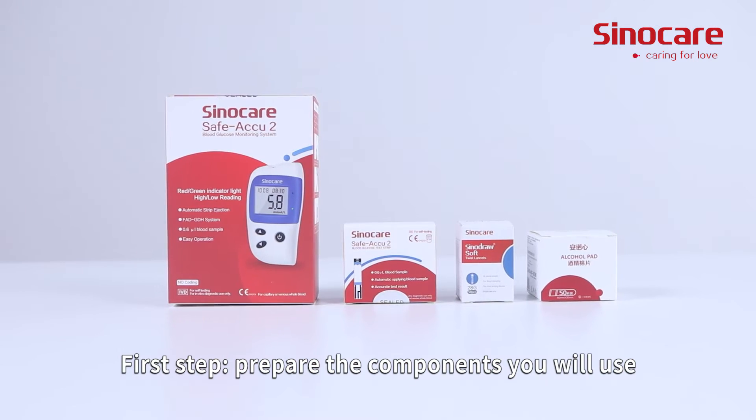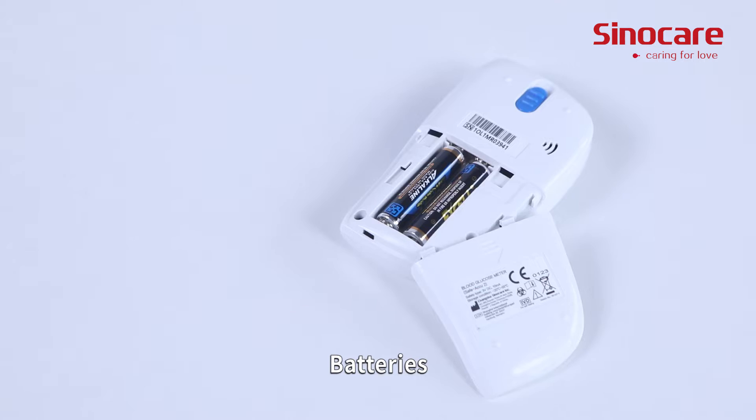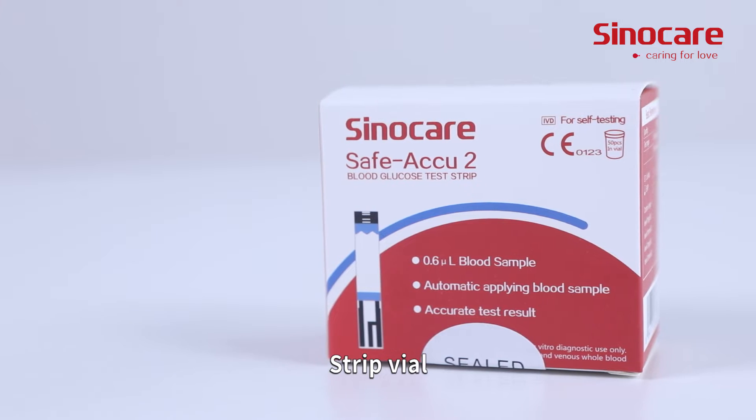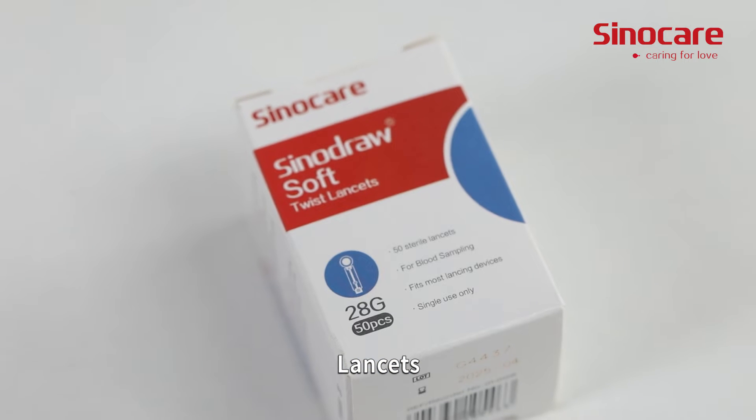First step: prepare the components you will use — batteries, glucometer, strip vial, lancing device, and lancets.